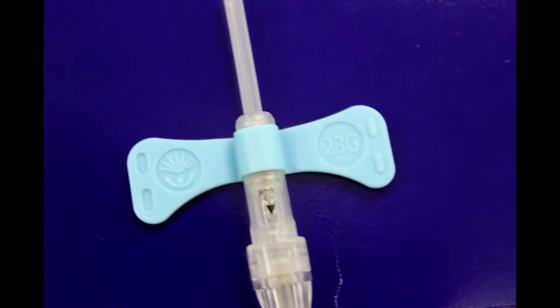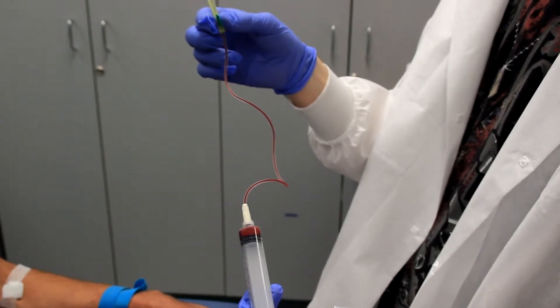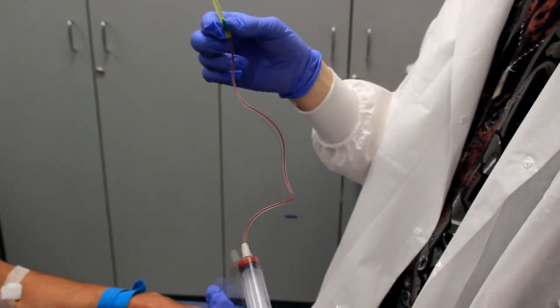Winged collection sets are also known as butterflies due to the distinctive wing-like grips on either side of the needle. In addition to these wings, the butterfly also comes attached to tubing that can range from 3 to 12 inches in length.